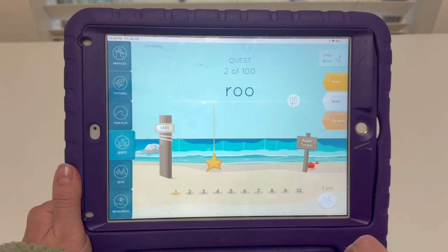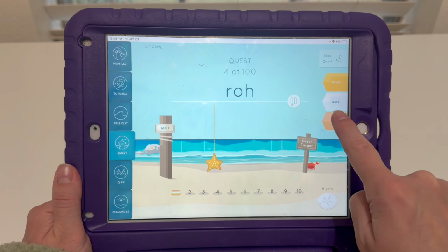While your student is practicing, you will help them score each production. There are 3 simple options. Gold would be a perfect, accurate R. Silver is not perfect, but showing improvement. Bronze means we're not there yet, so try again. You'll tap the score after each attempt. The app will even celebrate little wins, like hitting the most golds in a row. It helps keep practice fun and feeling like a game.